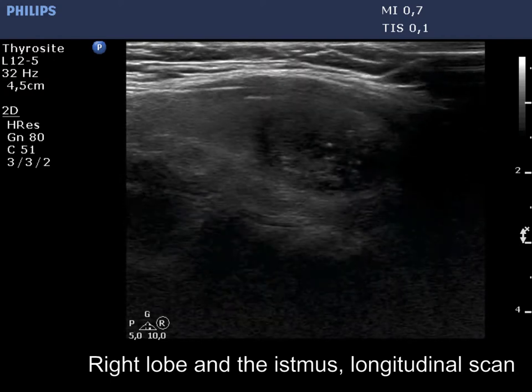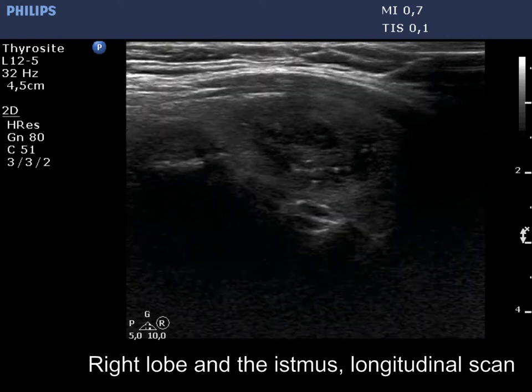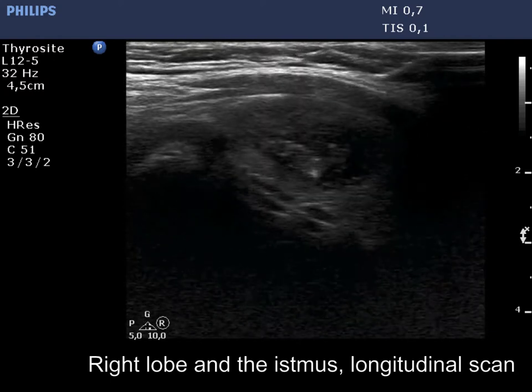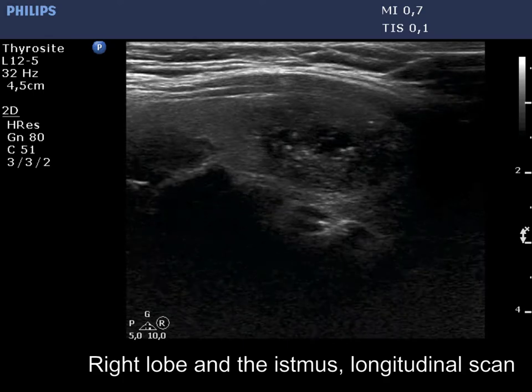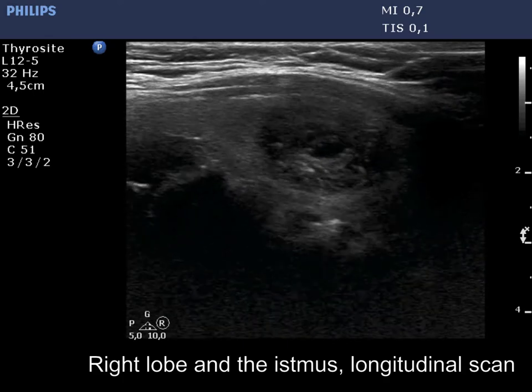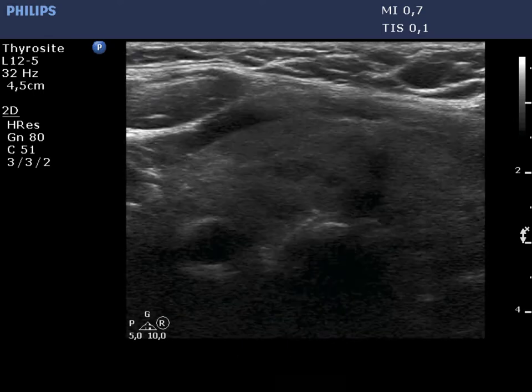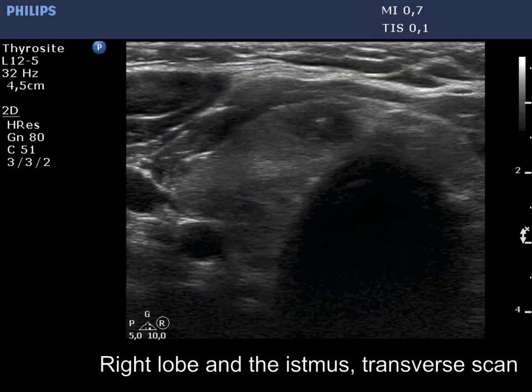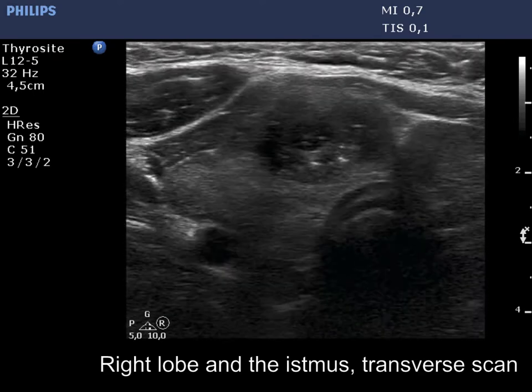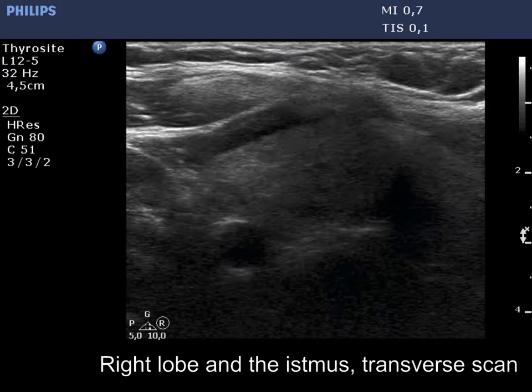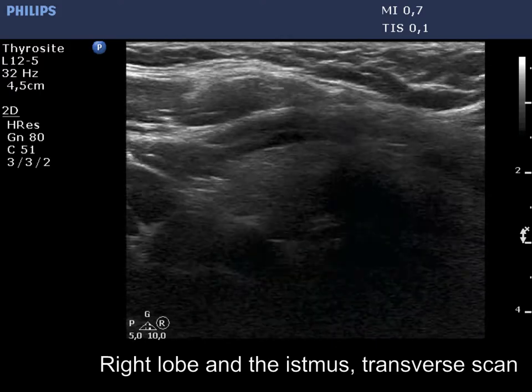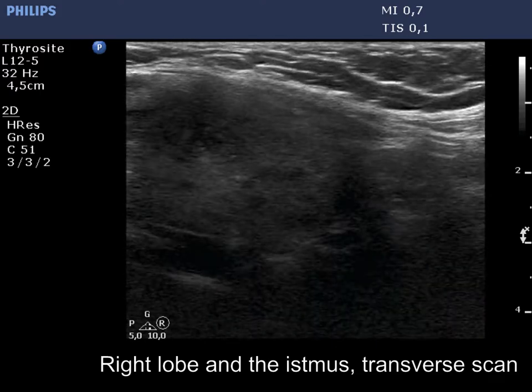The echogenic figures are partly related to cystic areas — these are back wall figures. On the other hand, some echogenic granules are very likely microcalcifications.